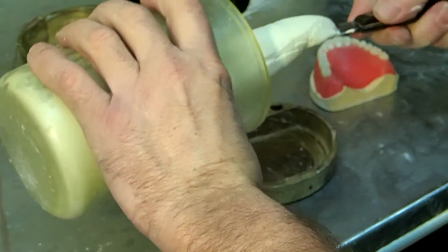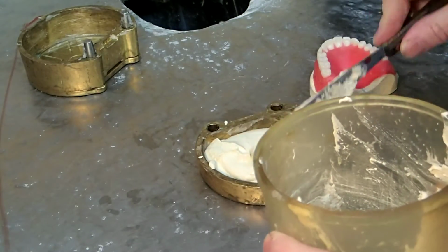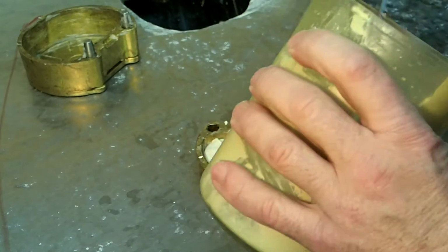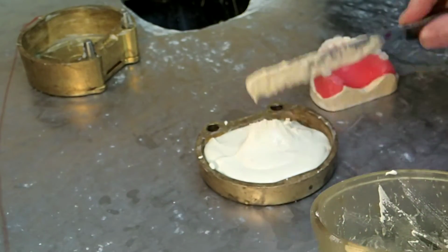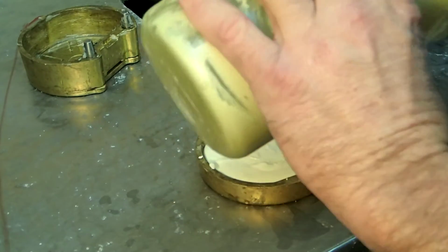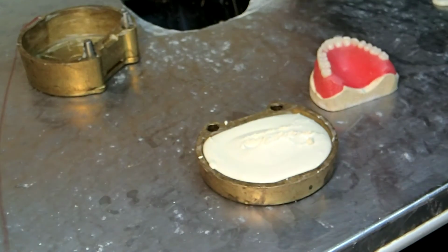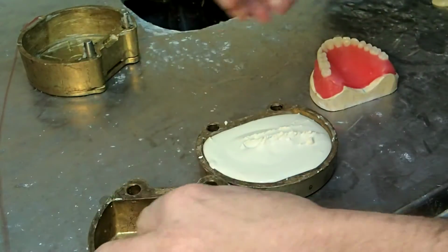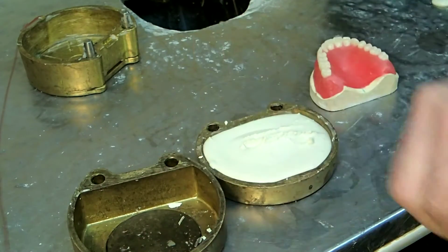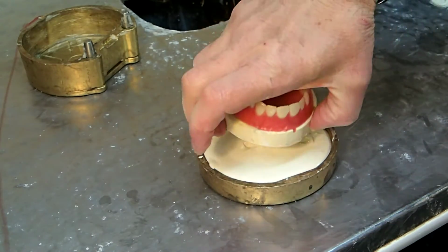I should mention that the flasks that you have are specific for upper and lower. This is an upper flask because the bottom of the flask is flat. If this were a lower flask, such as this one, the bottom is higher at the back of the flask than at the front. So I've mixed this stone up fairly thick. I want it to be pretty thick for this first layer of flasking.